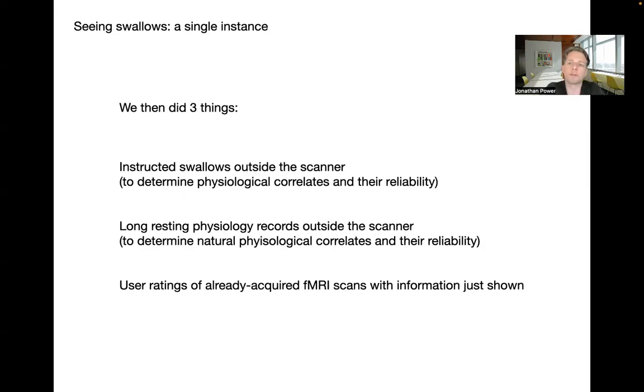So that was one kind of set of experiments that we did. And another was just to have people lie on a cot for a long time under the same kind of monitoring, where we had EMG on the neck, so we knew exactly when they swallowed. So I'll talk about those next, and then move back into the fMRI.